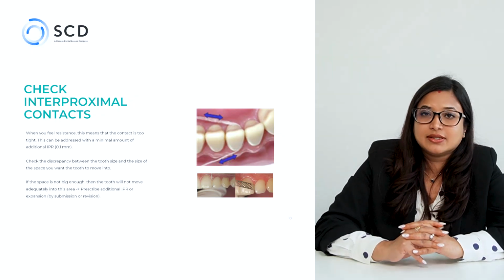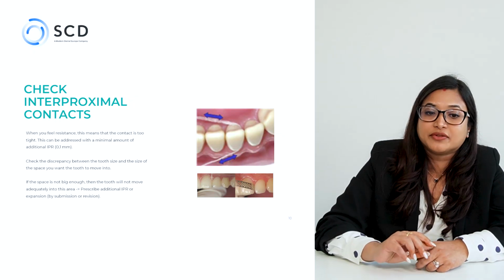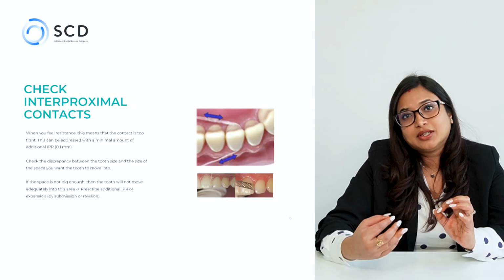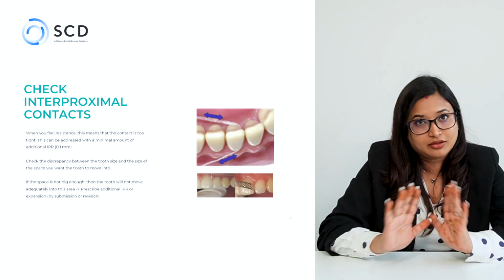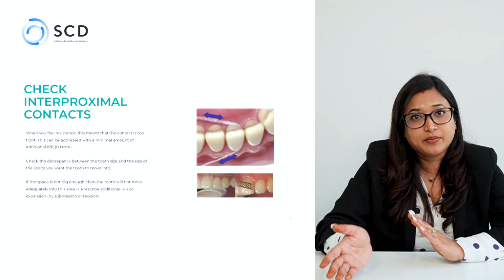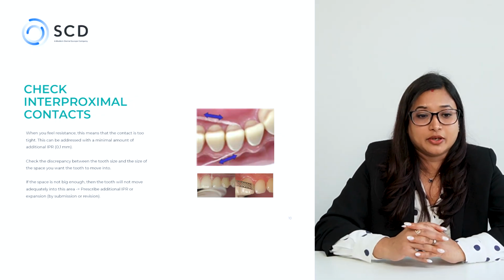When you feel resistance, this means that the contact is too tight. This can be addressed with a minimal amount of additional IPR. While using the dental floss, it should have a resistance, but not so much that when you're taking it out, it breaks every time. That means it's not creating enough space as required, and maybe you have to go for another IPR, which is very minimal, like just 0.1 mm, but still another session of IPR.